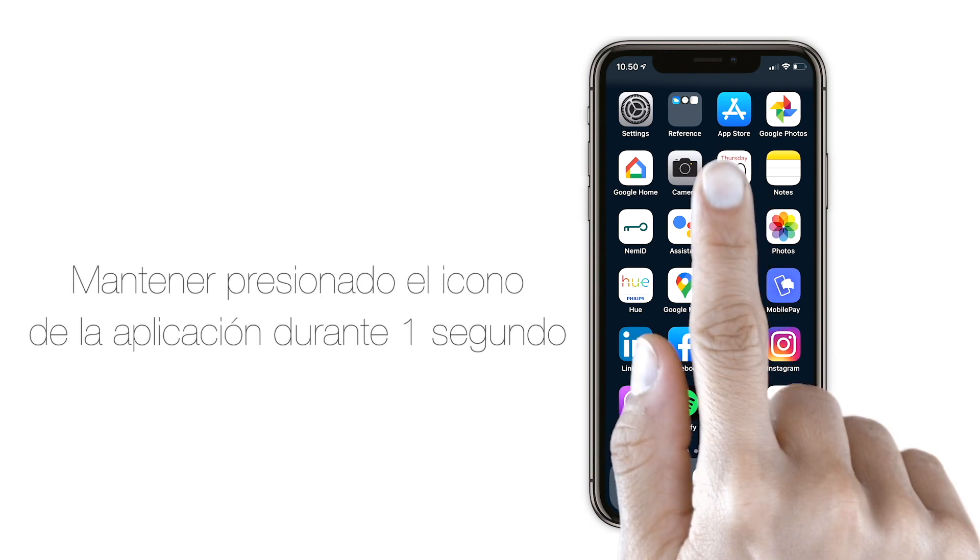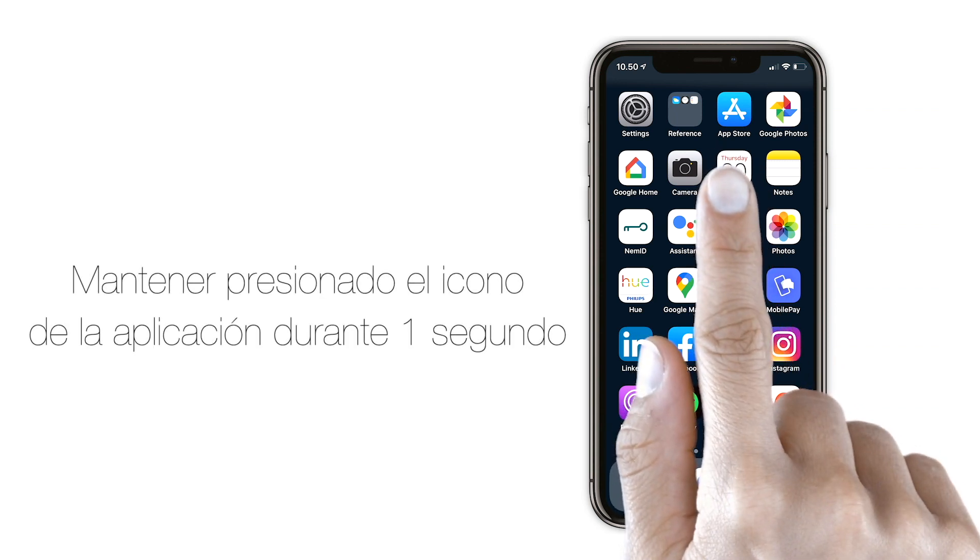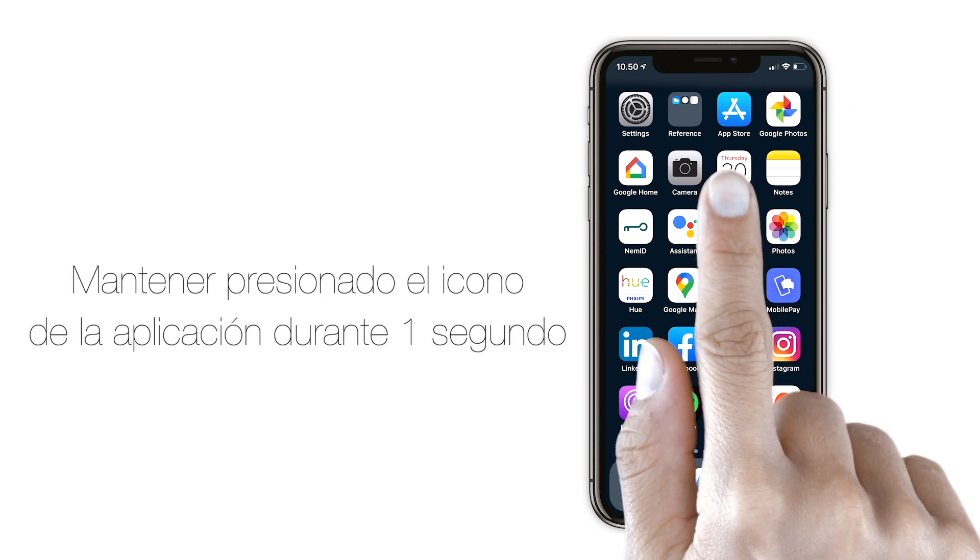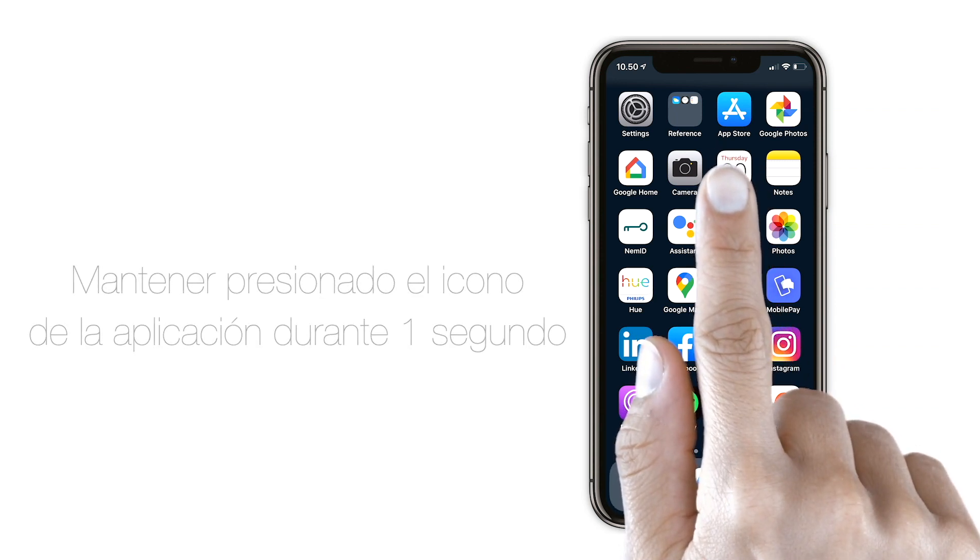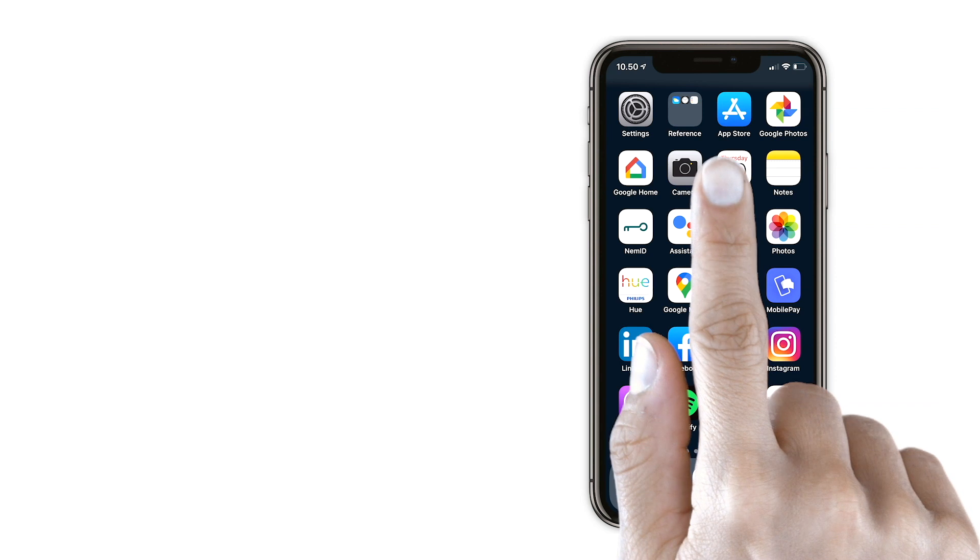Hold down the app icon for one second. Press Edit Home Screen.